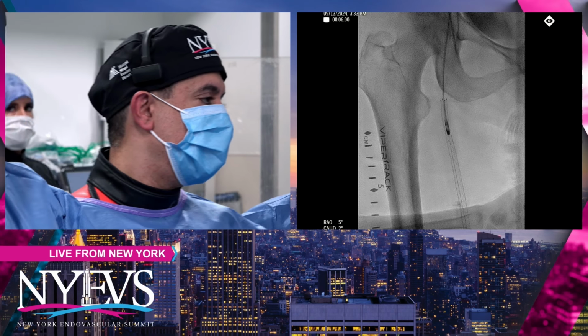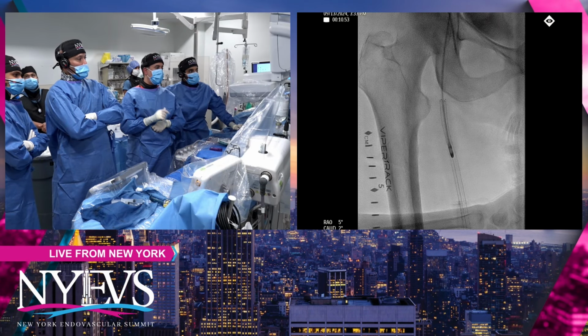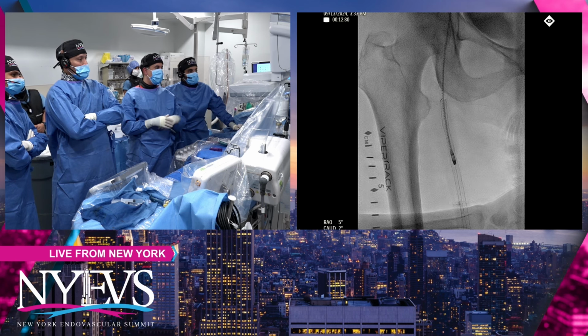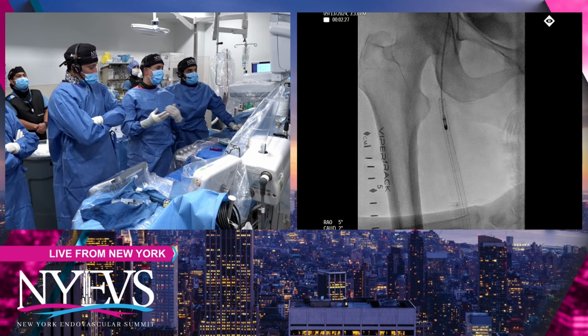And you can see it here. The stent kind of just sucking into the device. So we did, like I said, pecking in, out, slow. But again, look at that. Look at how the stent really collapses on you. And you can hear the machine essentially stall.